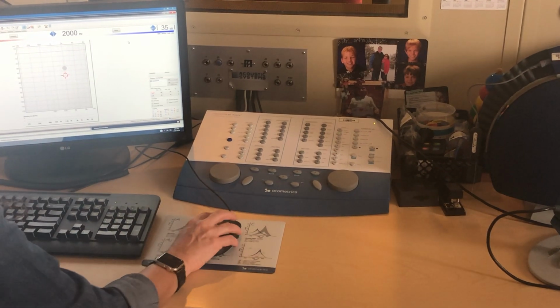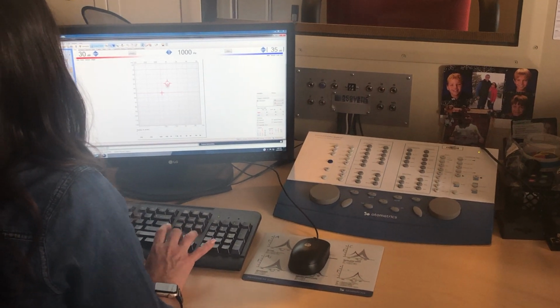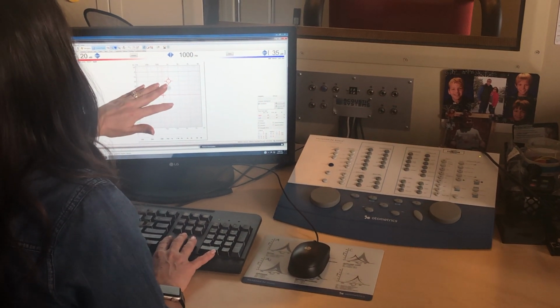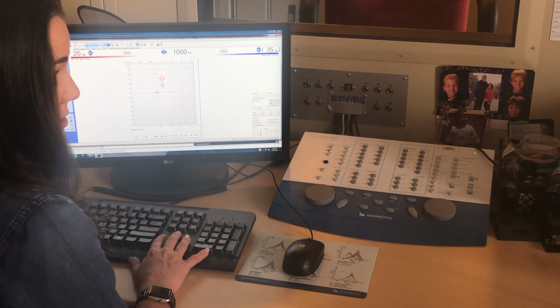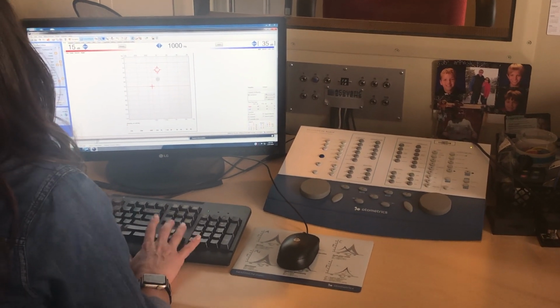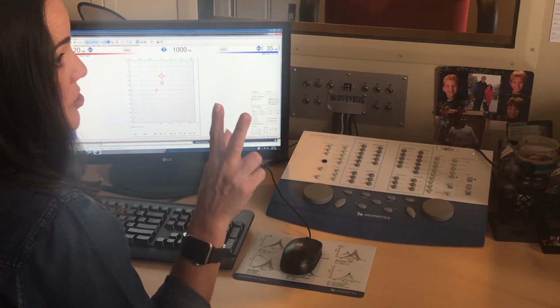Okay. Now one thing I do when I'm testing, pretty much when I'm doing my first threshold search, once I find that first level, a lot of times I'll go ahead and store it just so I know where it was, and then I'll go ahead and go up, present, present, present. They got it again. Oh, that's 2 times.